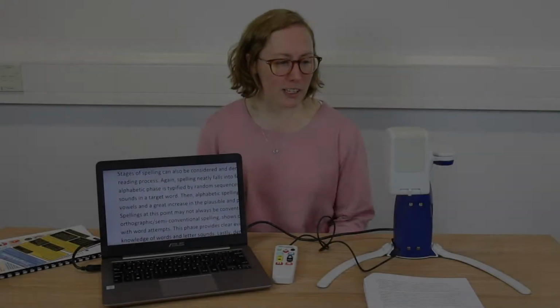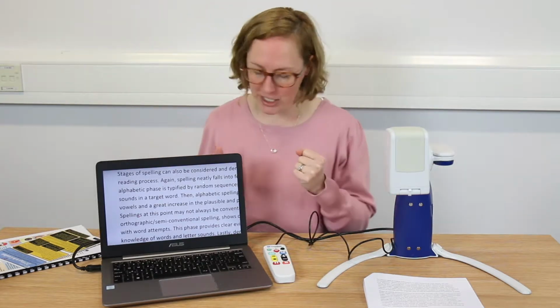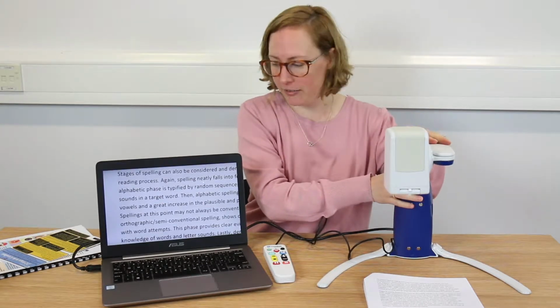So the device I'm going to show you now is called the Onyx PhD Desktop Video Magnifier. The Onyx video magnifiers come in several forms. The one I'm showing you is the PhD form, the P standing for portable, the HD standing for high definition. So the camera, this is the Onyx PhD itself.